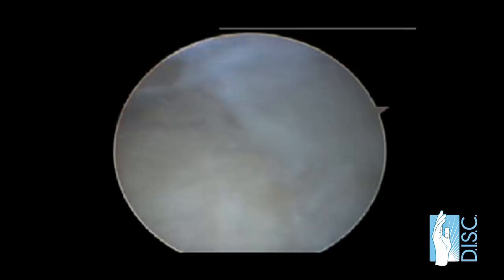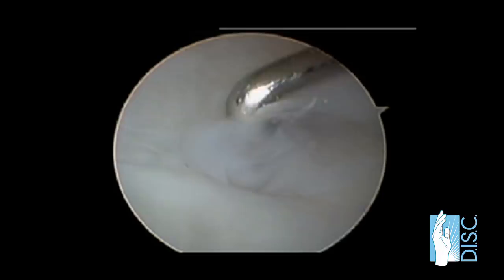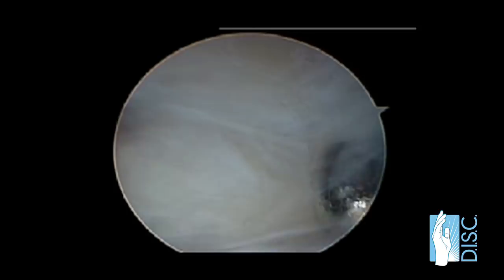Now I'm going through the triangulation technique with the opposite hand. I'm going to insert instrumentation. That is a small motorized shaver that I work with a foot piece, and it has suction attached. So like a little vacuum cleaner, I'm going to probe the area first, and then I will put the motorized device in to trim out the edges, these rough edges, so to speak, and smooth this out.